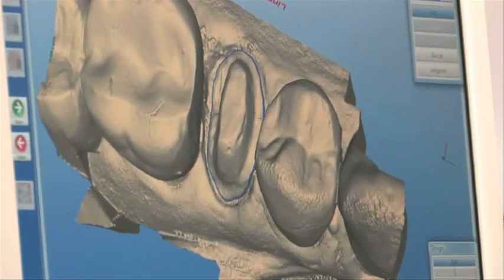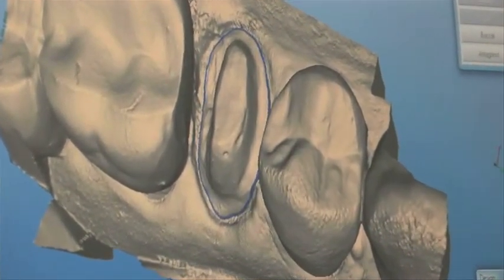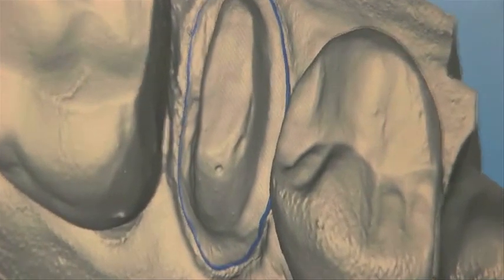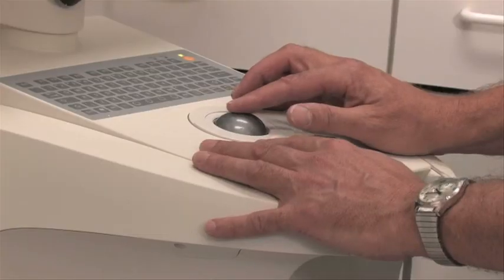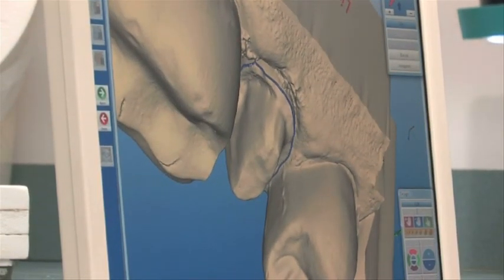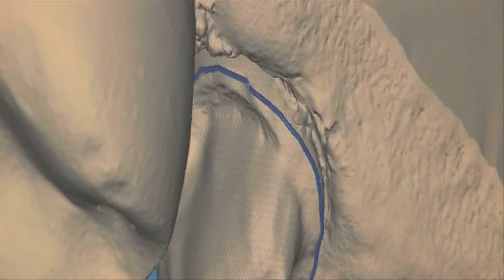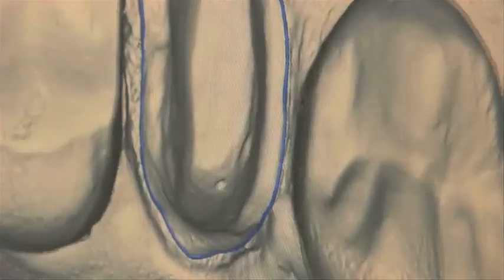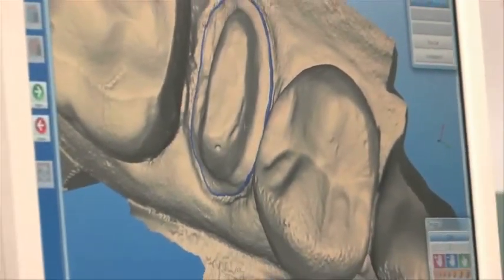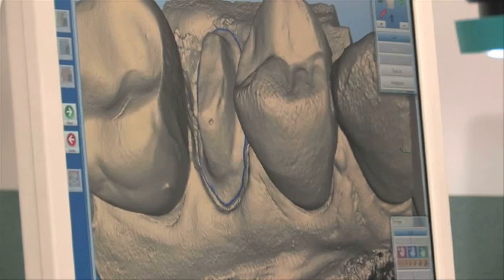We're here at the computer and we're establishing the margins, which is where the crown will end and the root begins. The blue line here is our initial pass at that. We're going to enlarge this and take advantage of digital technology. Now we're going to roll and take a good look at our margin as it goes all the way around the tooth. Over here I can see a slight correction needed, so we'll double-click there, fix that up, roll it and take a good look. I think we've got our margin, so let's go ahead now and prepare for designing the crown.